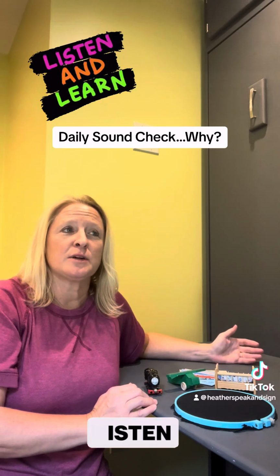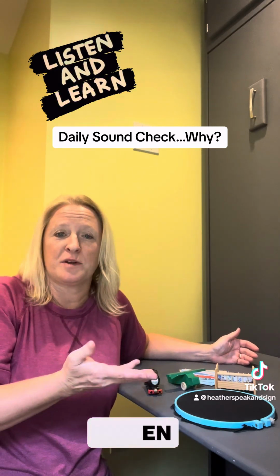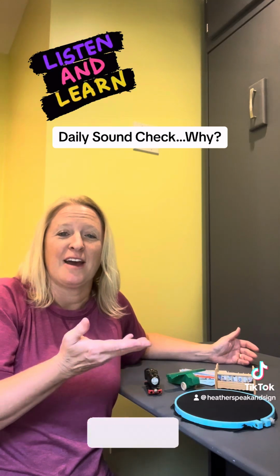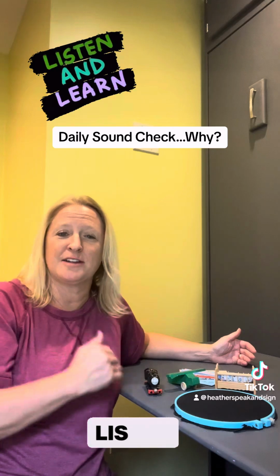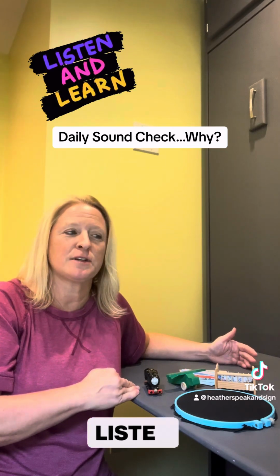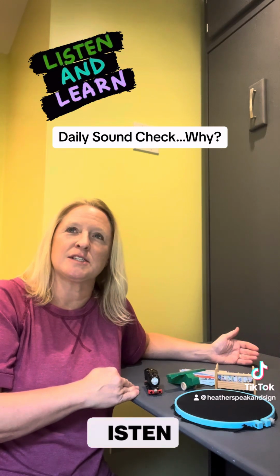But we also want to do it to make sure we have a foundation, a baseline for what they can and cannot do at this time. That's so that when they come to school and we do that daily sound check, we're using it for a different reason. Now we're using it to see what's different.